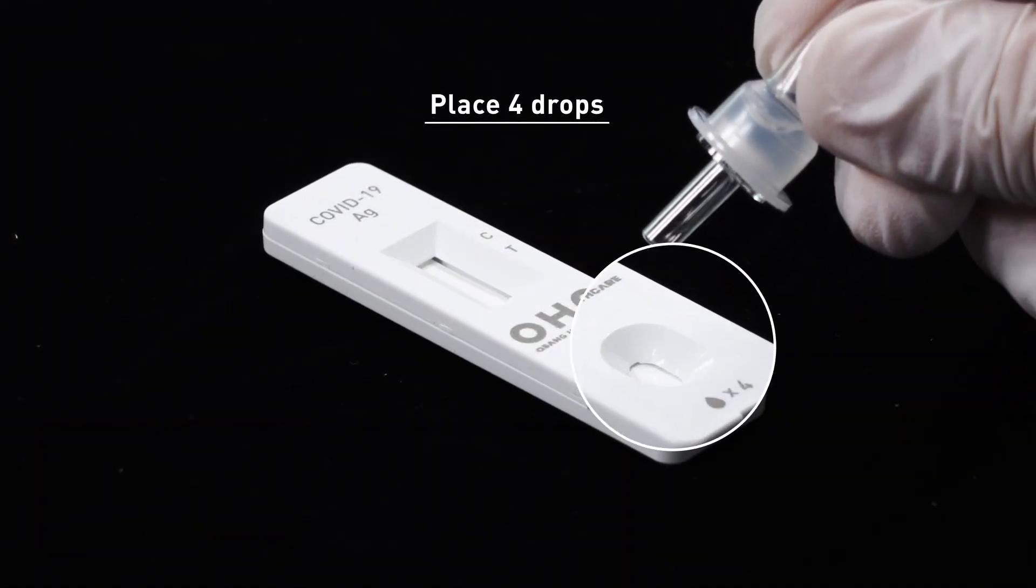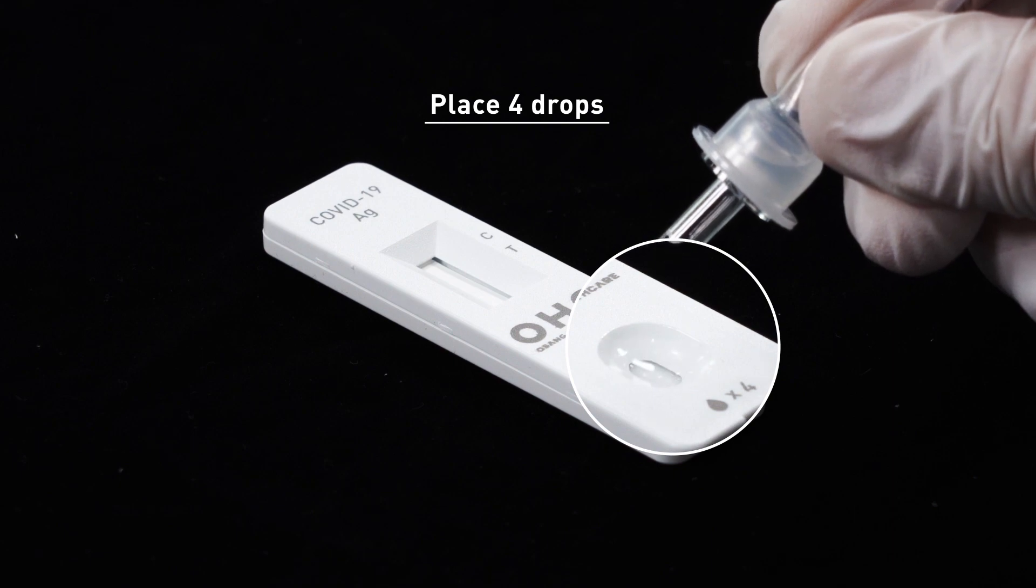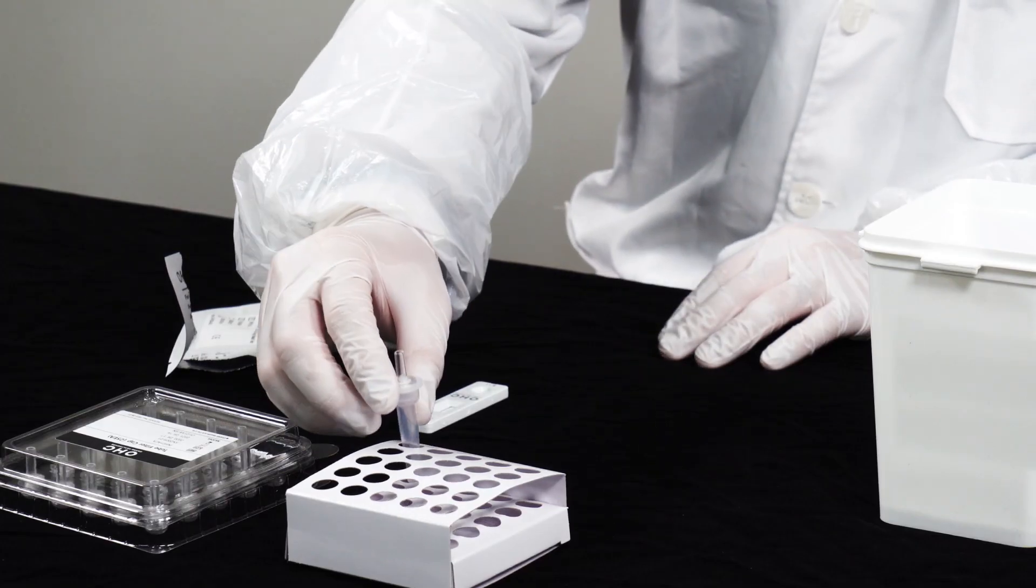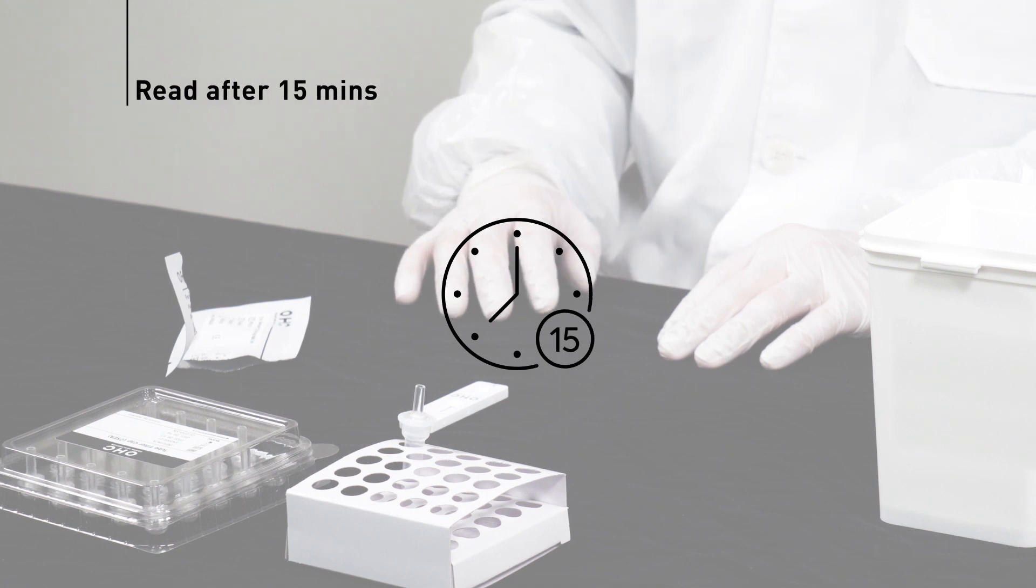Apply 4 drops from the extraction buffer tube onto the sample inlet of the cassette. Read the results after 15 minutes from the start of the test.